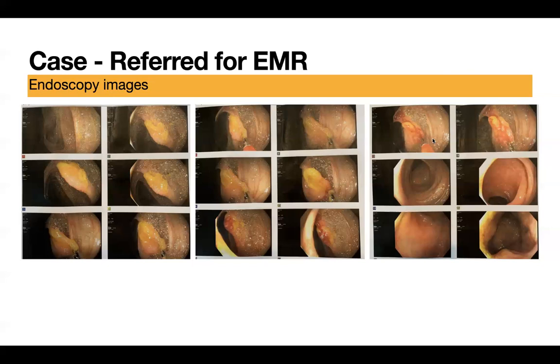I think one of the important things is to take at least 3 to 4 or 5 pictures to document that you are in the cecum. Sometimes when you take a picture very close to the appendiceal orifice, you can take a similar picture from a diverticulum and make it look like an appendiceal orifice, right? So it's important to do that. And I never feel comfortable that I reached the cecum until I actually saw the villi of the TI or villi close to the ileocecal valve.